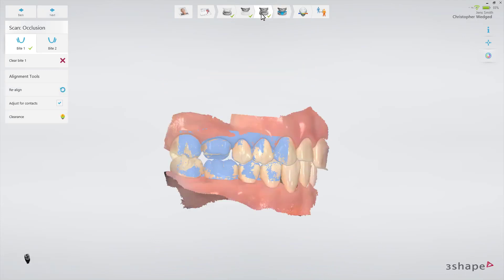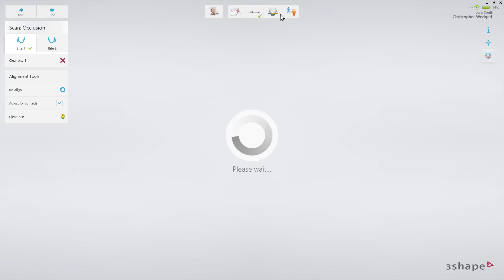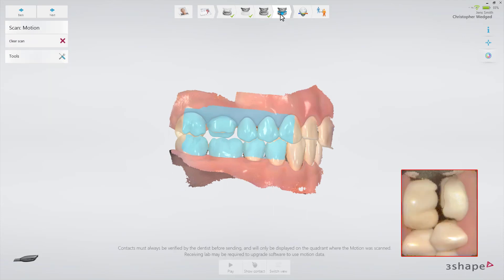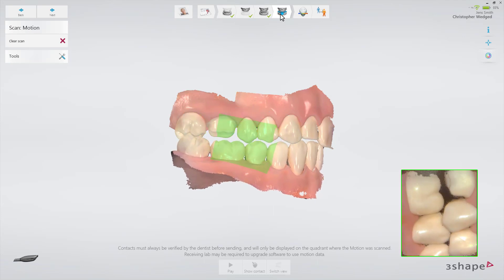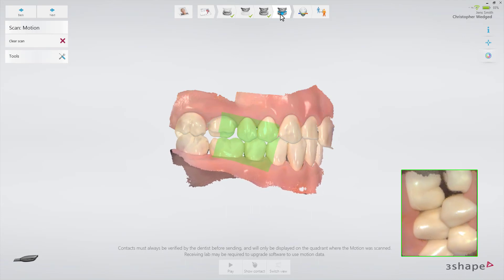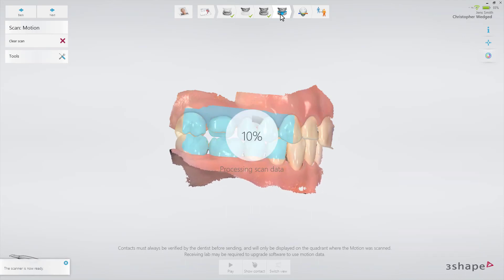After completing the bite scan, click to go to the patient-specific motion page. Make sure you create the patient-specific motion scan only on the side where you want to make the restoration. Start scanning on the blue marked area. When the area turns green, instruct the patient to start grinding the teeth in the desired direction. When you are satisfied with the recorded motion, stop the scanning.